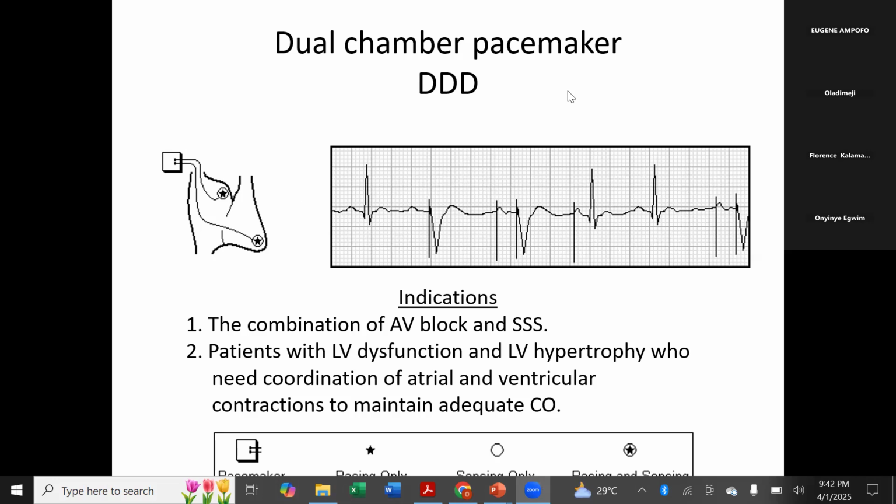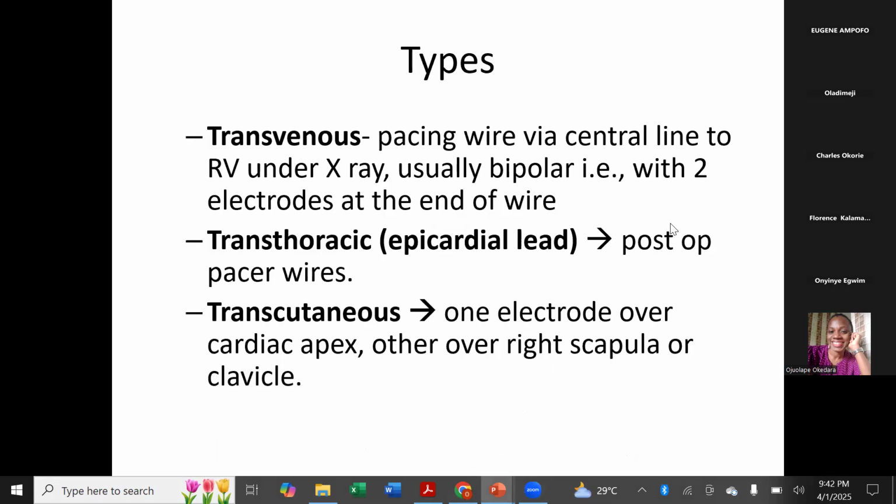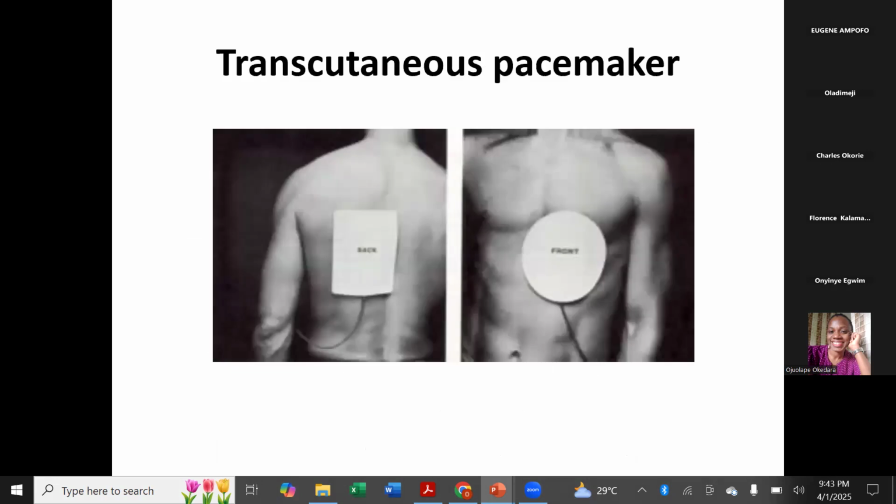Okay, all right, great. So we all know everything about temporary pacing, so I will just round up the slides with a few slides on malfunctioning. We know things about temporary pacing: epicardial pacing, transvenous, transcutaneous pacing. We have the transcutaneous pacing pad. The same defibrillator we use can actually pace. So that's the transcutaneous pacing.